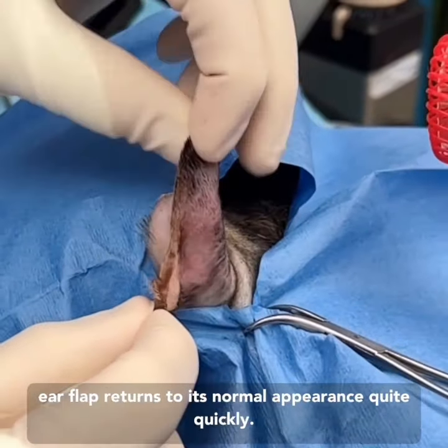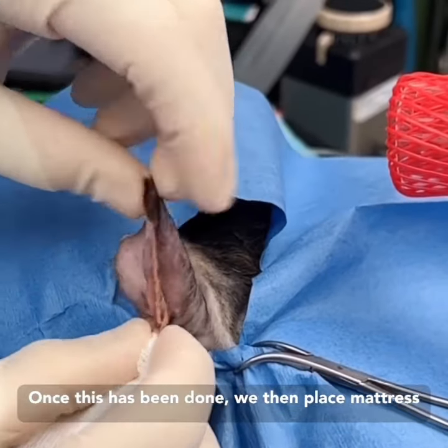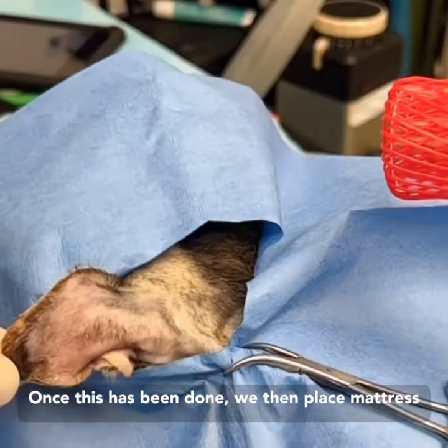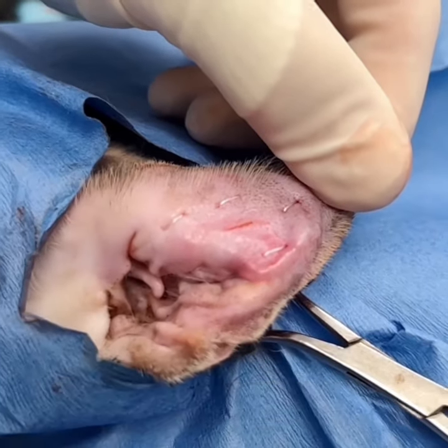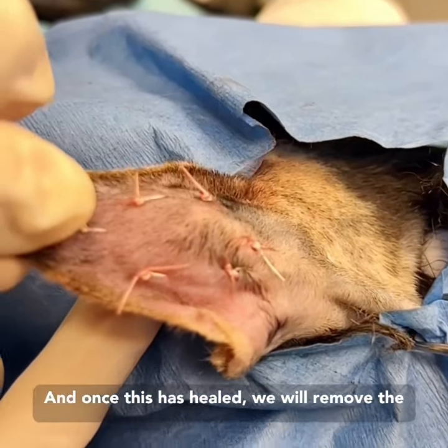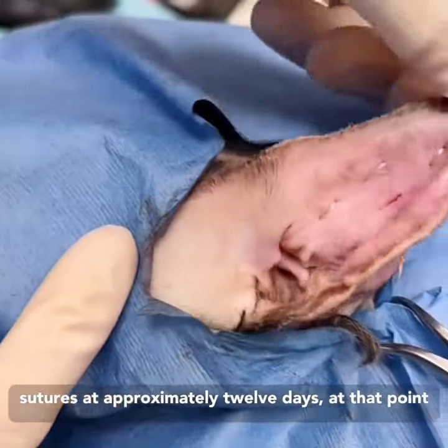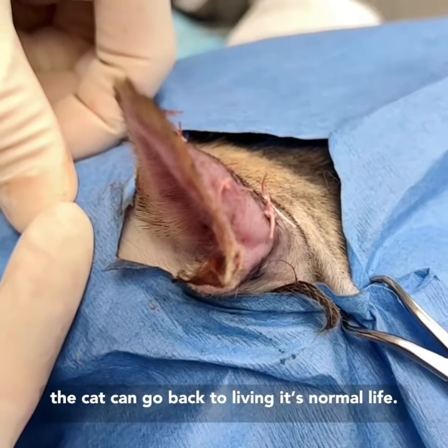You can see that the ear flap returns to its normal appearance quite quickly. Once this has been done, we then place mattress sutures to keep the ear closed and to allow it to heal. We will remove these sutures in approximately 12 days, at which point the cat can go back to living its normal life.